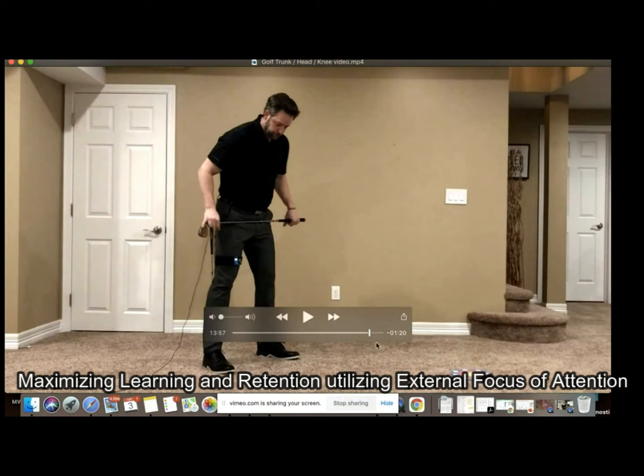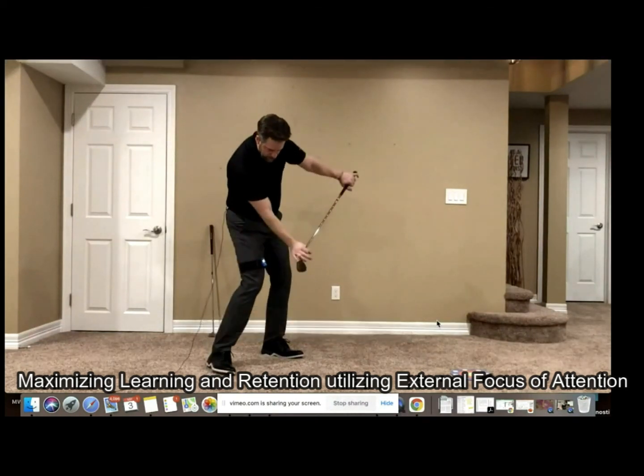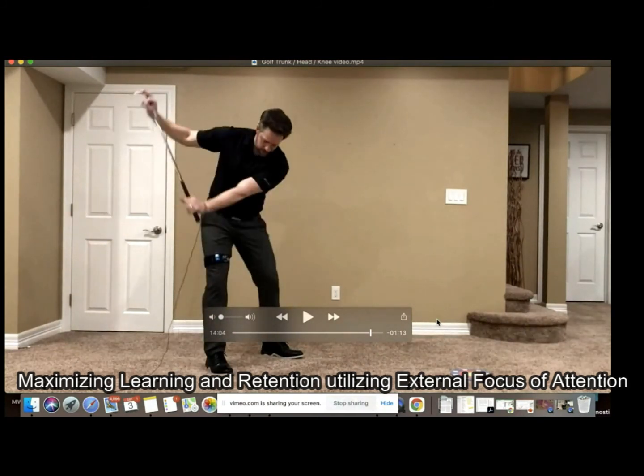And then once you start out with some basics, you might want to go on to even more dynamic activities here. So if we put the motion guidance laser on my knee here, and again, these are on our YouTube video if you want to go and access those, but showing, let's see if I can scroll through here, get rid of this. Nope, it's going to stay there. So as I want to cue a certain move with my right knee as I swing the golf club down and through, that laser is going to come close to my left knee.